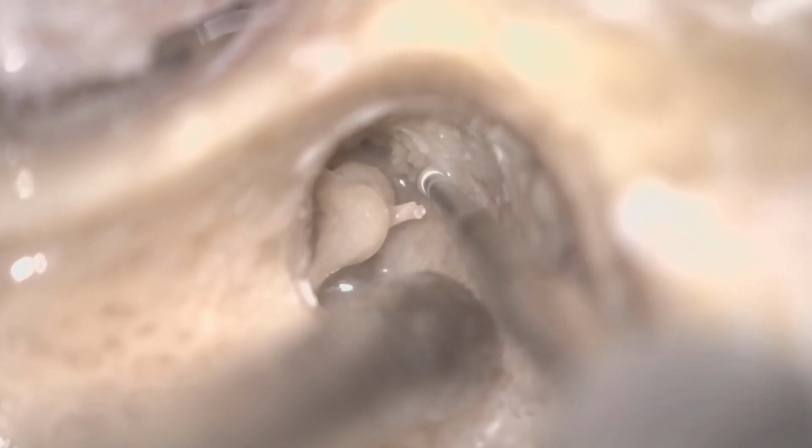This is the anterior part. If you Google the term cog, it means a wheel, just like a bearing. So there will be multiple projections that arise from the cog. That helps to identify, yes, this is the cog. And for the surgical part, this is very important.